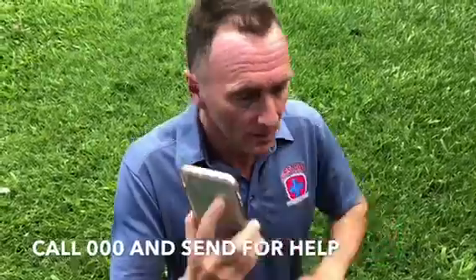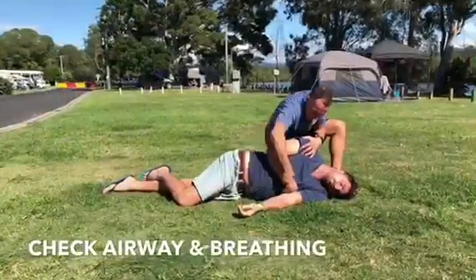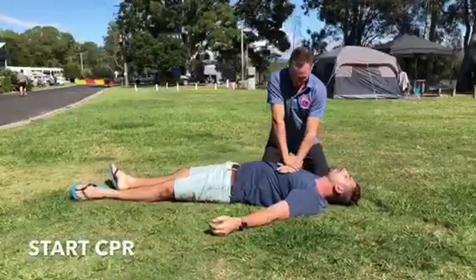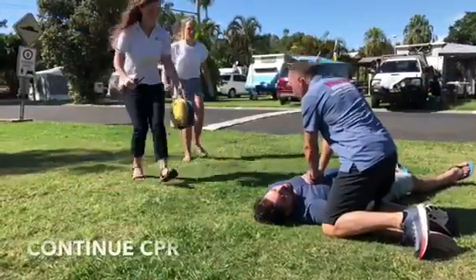Get your phone out, call an ambulance, and send someone to retrieve the defibrillator and bring it back to the patient. If you can hear me. It's important with first aid at this point in time to check airway and breathing. If there is no breathing, roll the patient onto their back and start performing CPR until the defibrillator turns up.